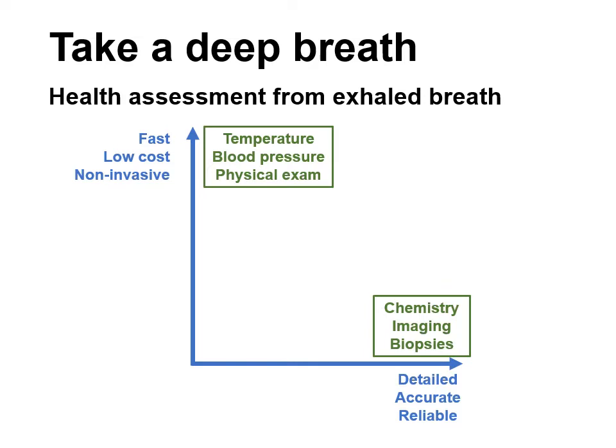The promise that breath analysis can provide is that it can be a combination of both of these. It can be fast, low cost, and non-invasive, and it can also be detailed, accurate, and reliable. So that's the opportunity that exists for using breath biomarkers for health research.